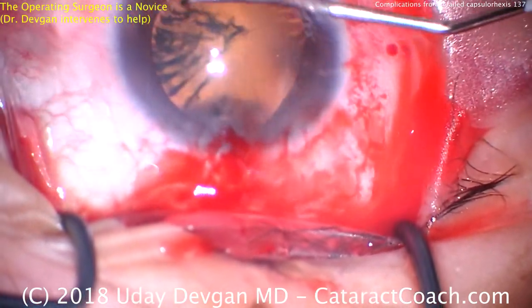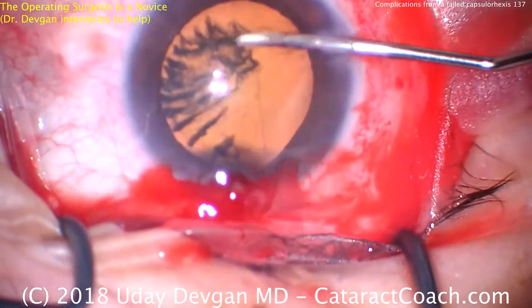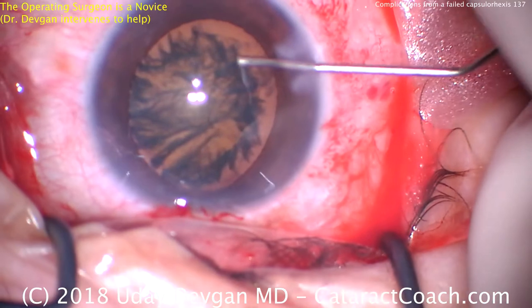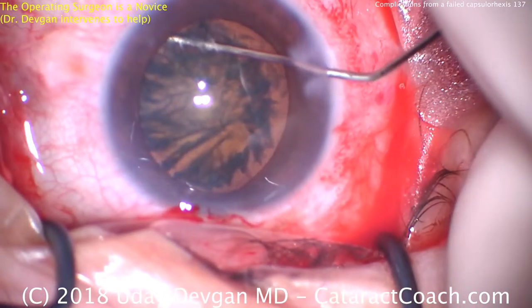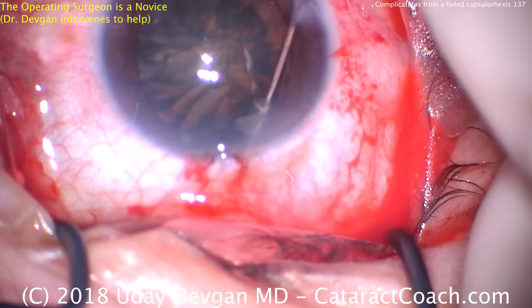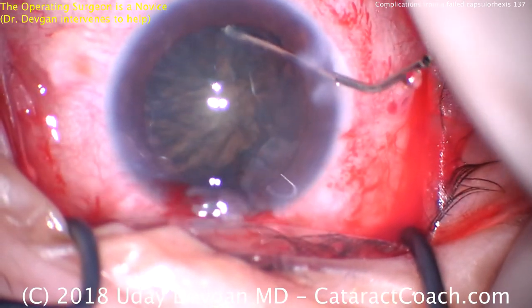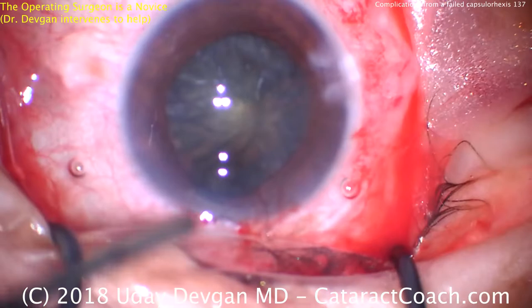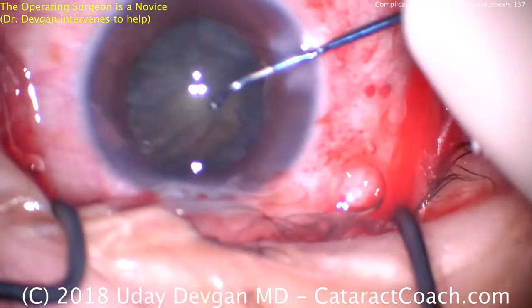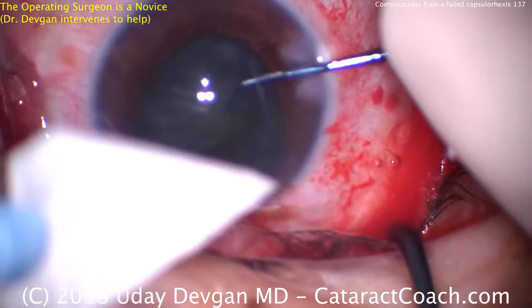I'm intervening now, sitting in the assistance position. We are making a can opener type capsulotomy for 360 degrees. The can opener capsulotomy has many areas where the forces during surgery can be spread outwards. If you just have the one radialized area, all the force goes towards that one area and it can zip around to the posterior capsule and rip it wide open. By having many areas, we're able to avoid that issue because the forces are spread out equally.